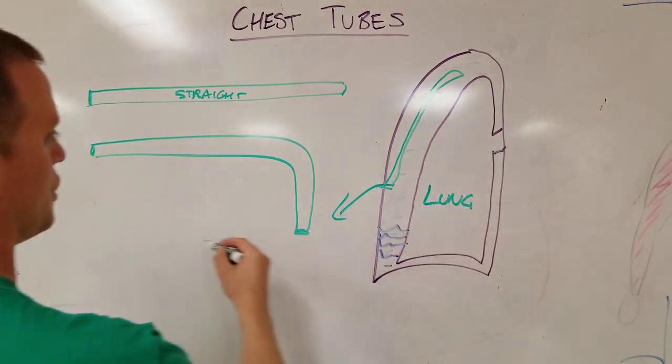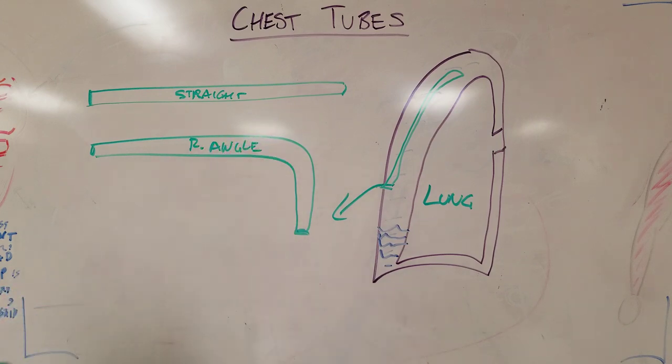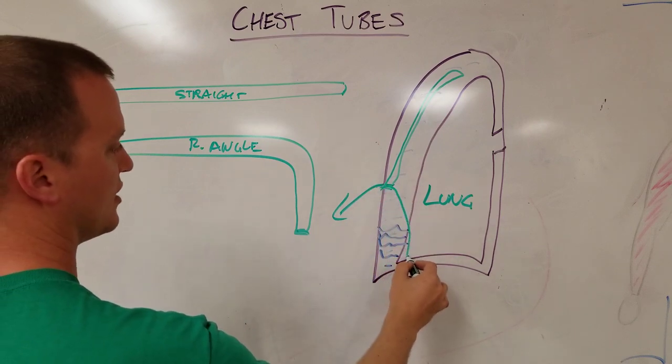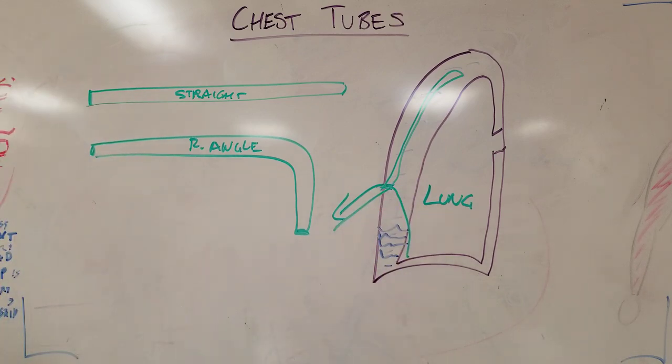That's why they're straight, so they might start here, and they'd come up here to the apex. Whereas your right angle ones are designed to go into the patient's base, or the base of their lung, or the base of their pleural cavity, I should say. So when it comes in, it tracks down into the patient's base. It has that nice right angle curve to get you there.